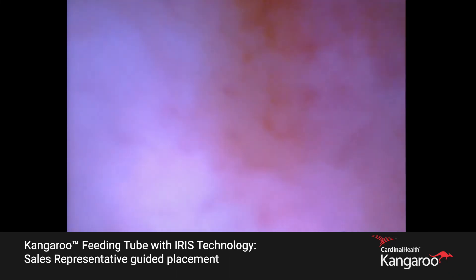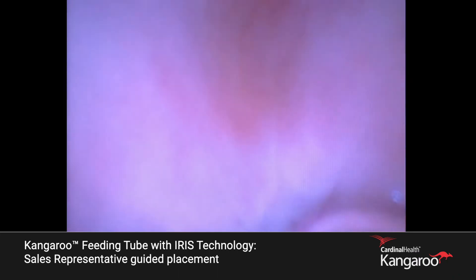Once we get deeper into the stomach and pass through the pylorus, the smooth tissue will become more finger-like projections — you'll see depth and texture. Slowly take your time. What depth are you at? About 80. We're starting to see a lot of white blanching, so let's come back — we're just caught in a little fold.